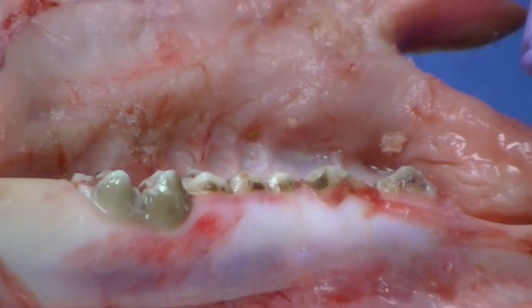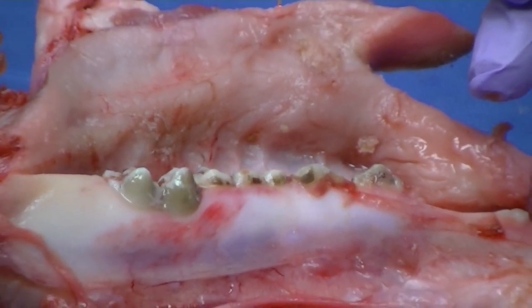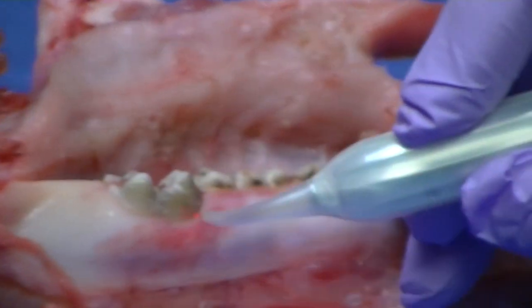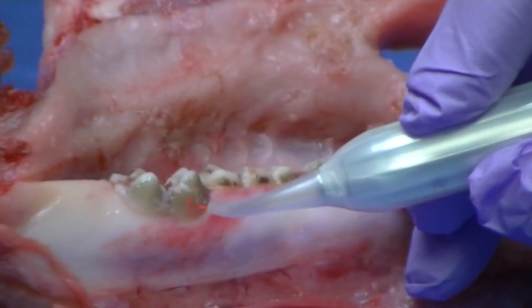Another thing you can work on is the desensitization of teeth. This one is going to be a cold tip as well, a non-initiated tip, and you're not even going to touch the tooth.